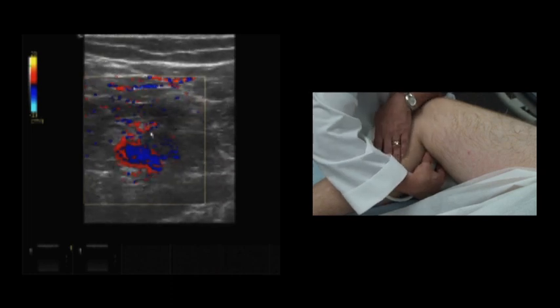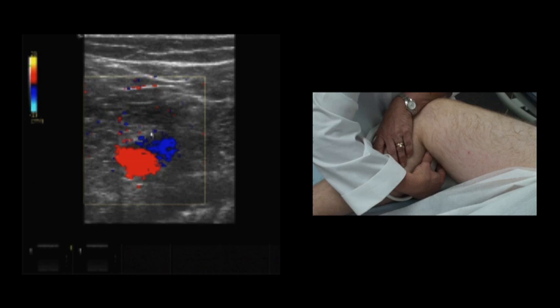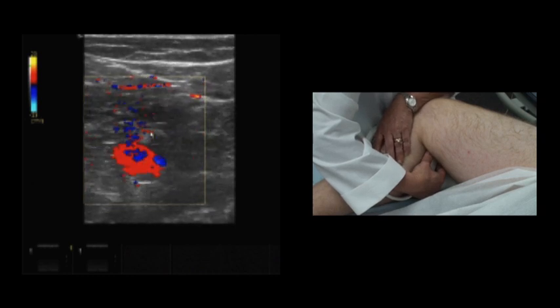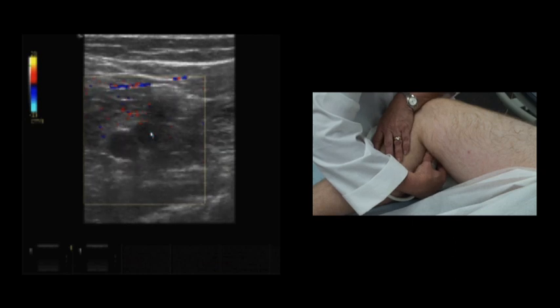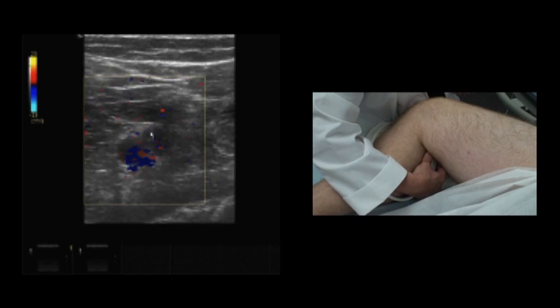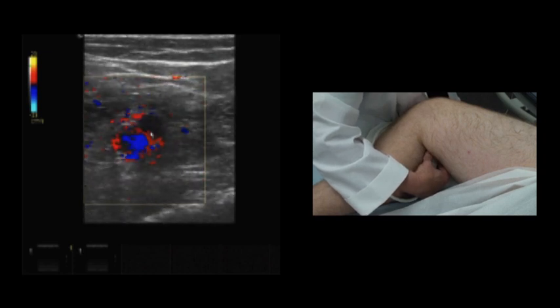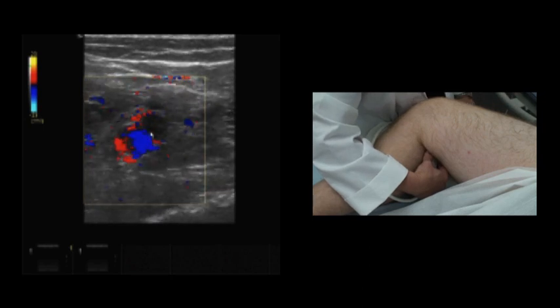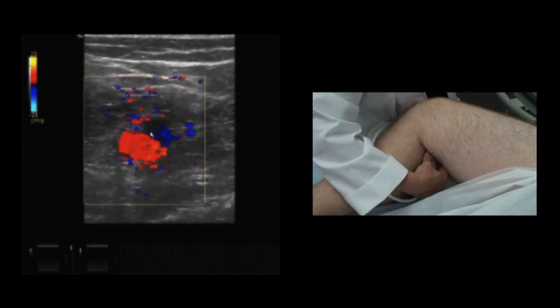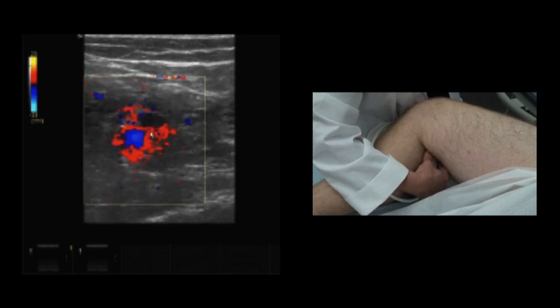Breathe for me. Okay. And this moves with respiration, and this is normal. In the evidence of DVT, we will have more of a continuous flow within the color. If it is completely occluded, there will be no color absolutely at all. And if there's partial, that color will move around that DVT. It's also very beneficial at the time when we have what we call a free-floating thrombus. In transverse view, that's our best view to be able to see all the walls, and we can see the color moving completely around that thrombus.